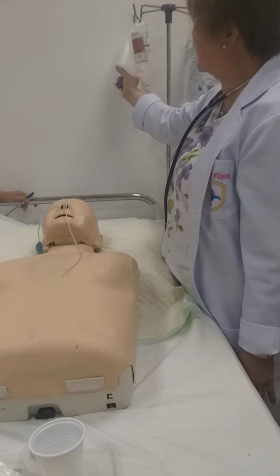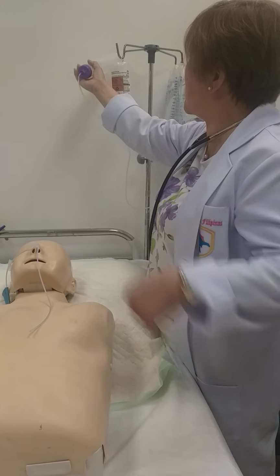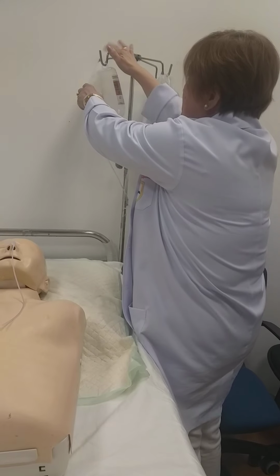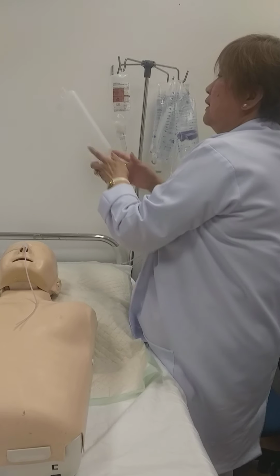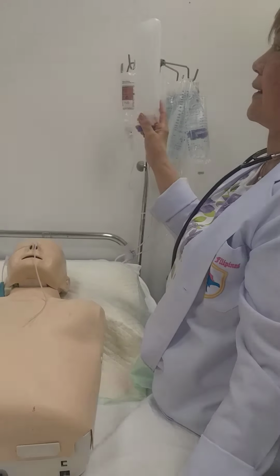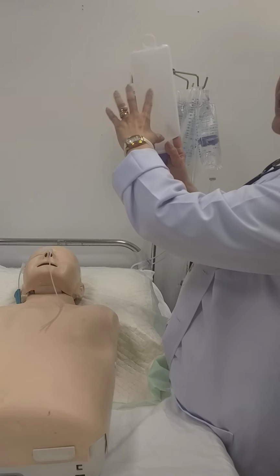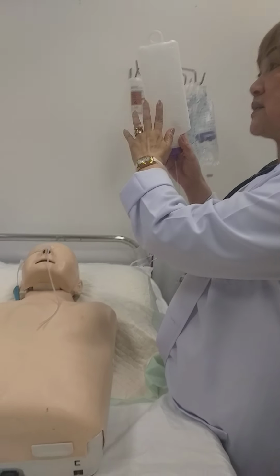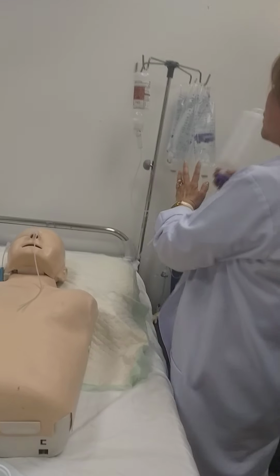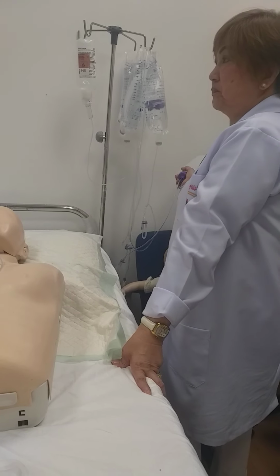This one is the tube where we put our feeding. So this will be around 1 liter, 1,000. Okay, so if you find it like this, if it is 1,000, you have to check the name of the patient. You have to check whether it is expired. And this, you will get it from your refrigerator.